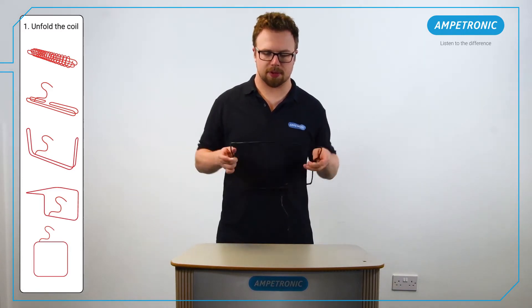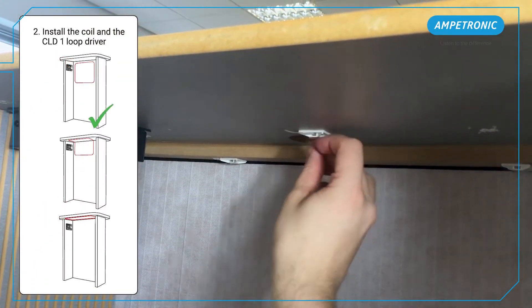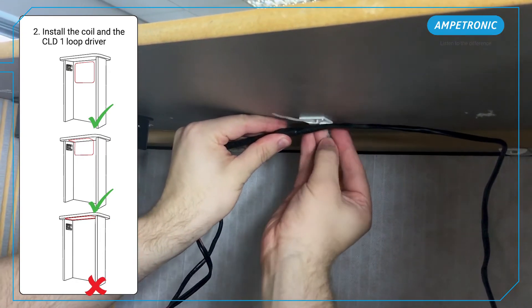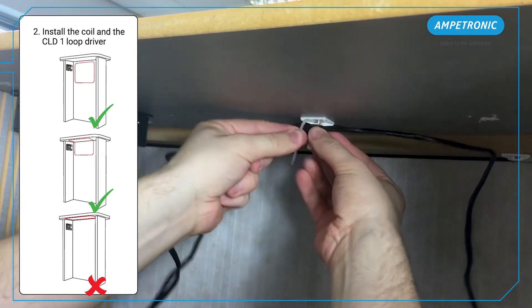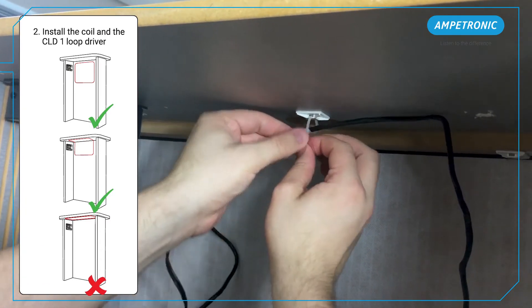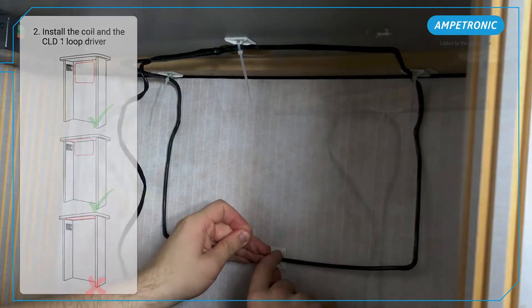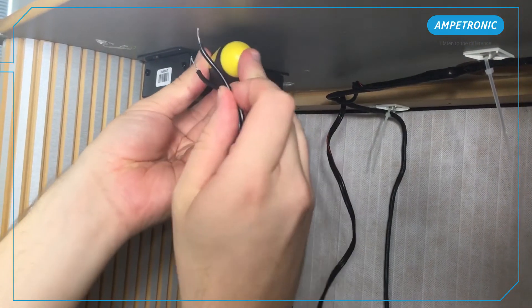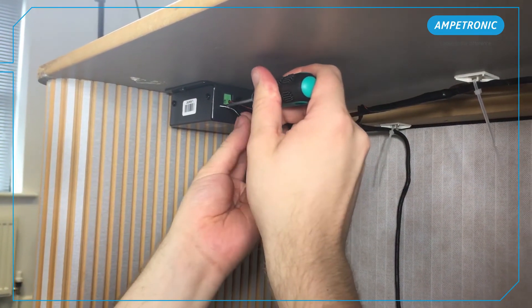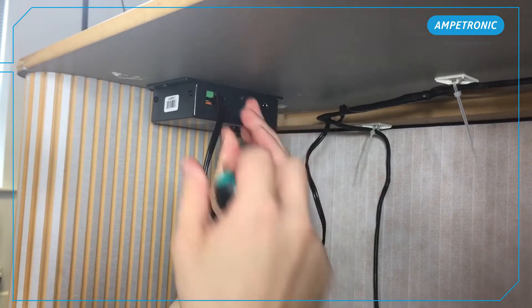Make sure that the coil is unfolded to make a rectangle before installing it in position. Put a fixing on the top of the coil position to allow the coil to be held in place. With the coil in place, fix the rest of the cable tie pads to hold the loop securely in position. If preferred, you can use other fixing methods such as staples or P-clips to hold the coil in place. There is also an option to purchase the coil in a fabric pad if the installation might be visible. You can cut the excess feed cable to length or use cable ties to neatly bundle it up, but make sure it's folded back on itself rather than coiled.